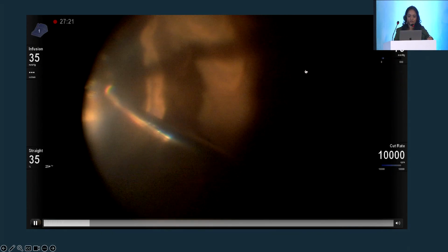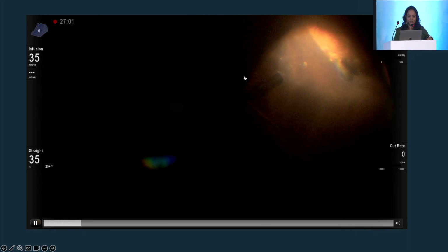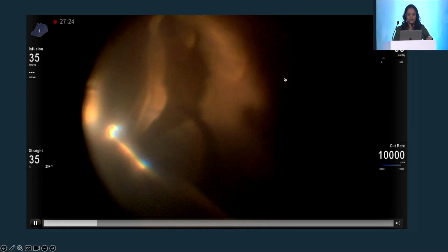And you can see this is the foreign body when I did an indented demonstration for the onlookers in the OT as well. This is the foreign body. And you can see how pale and yellowish brown the retina is. That is also a siderotic retina.